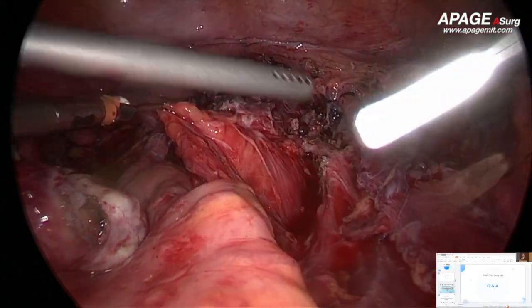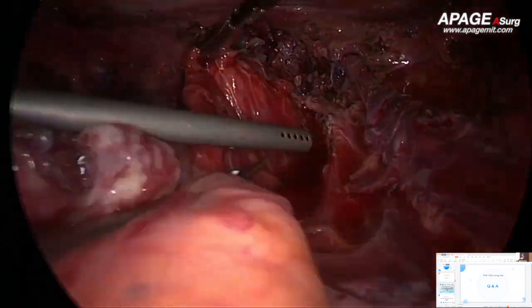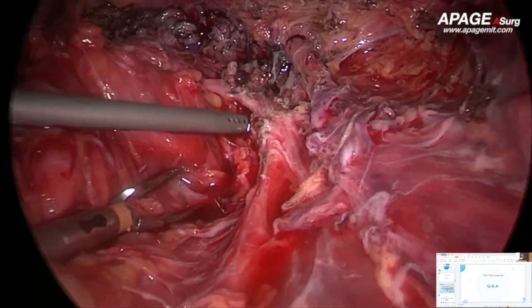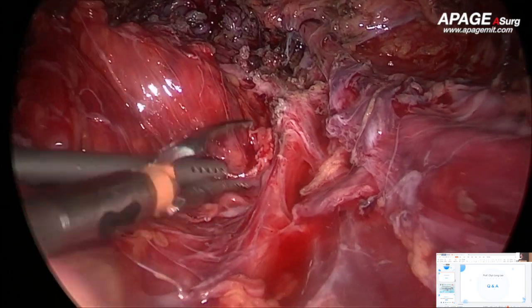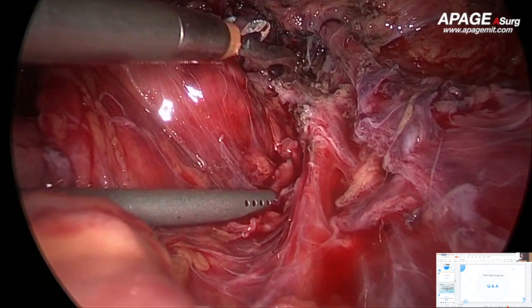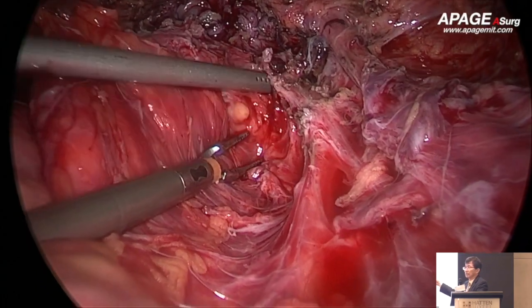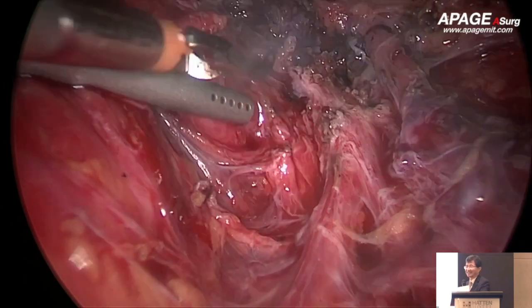Just an interesting question. How long did this actually take to do, on average? We have sped up to about three and a half hours. Actually, in regular cases without severe adhesions, we take 2.5 hours to perform the laparoscopic radical surgery. Another one hour is for the deep endometriosis, so it takes one more hour, yes.